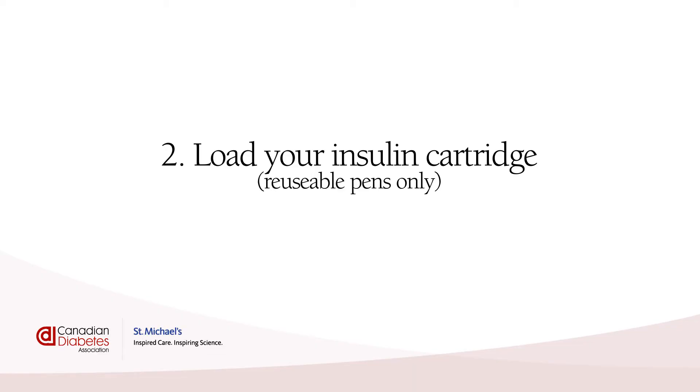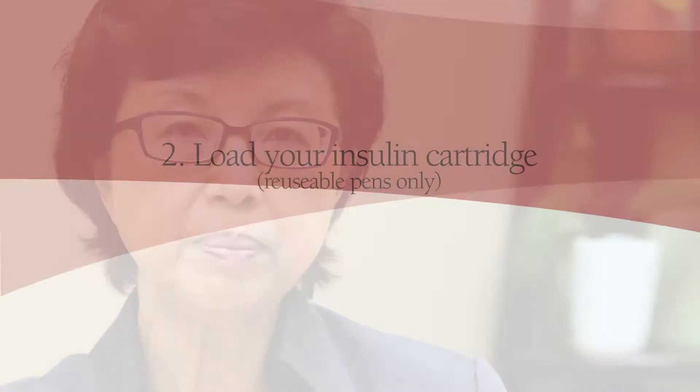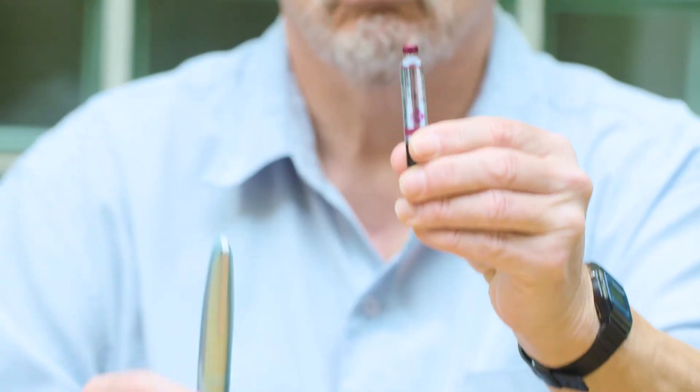Load your insulin cartridge — reusable pens only. This step is only for people using a reusable pen. If you're using a pre-filled insulin pen, you can skip ahead to step 3: mixing the insulin.